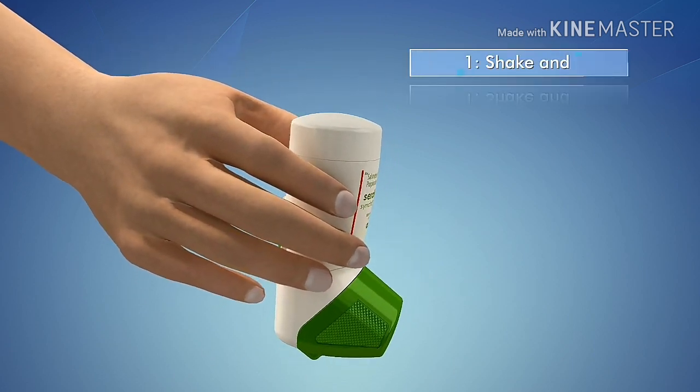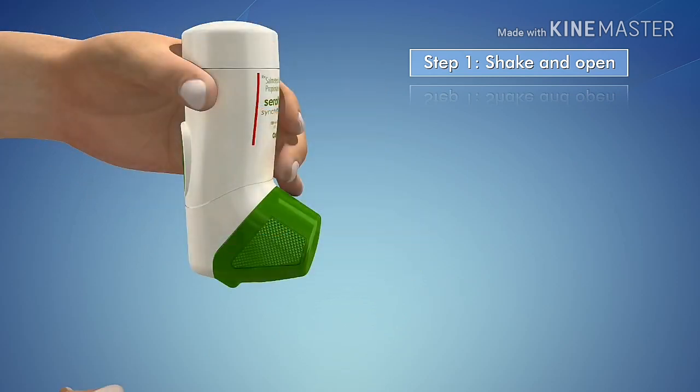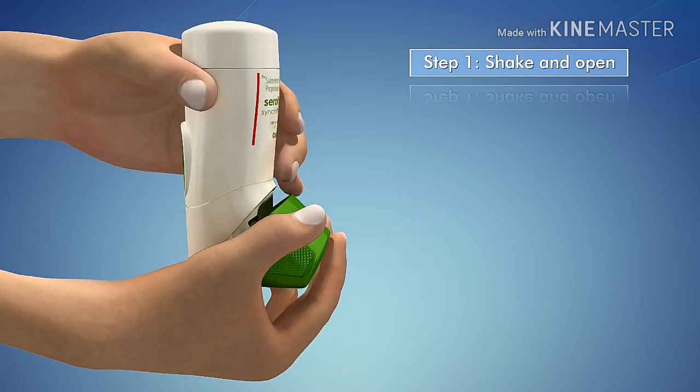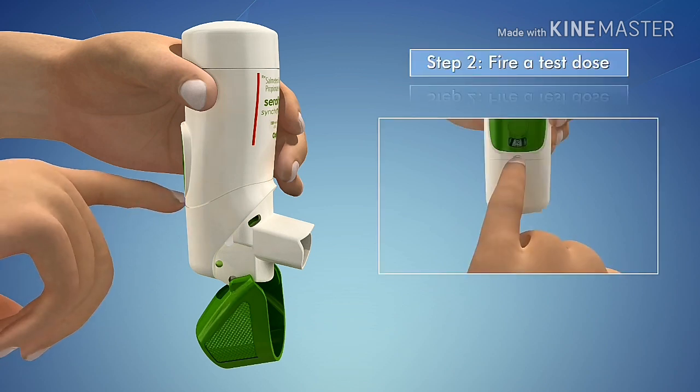Step 1. Shake the inhaler well and open the inhaler by folding down the mouthpiece cap. Step 2. Push down the dose-release button located at the back of the inhaler.